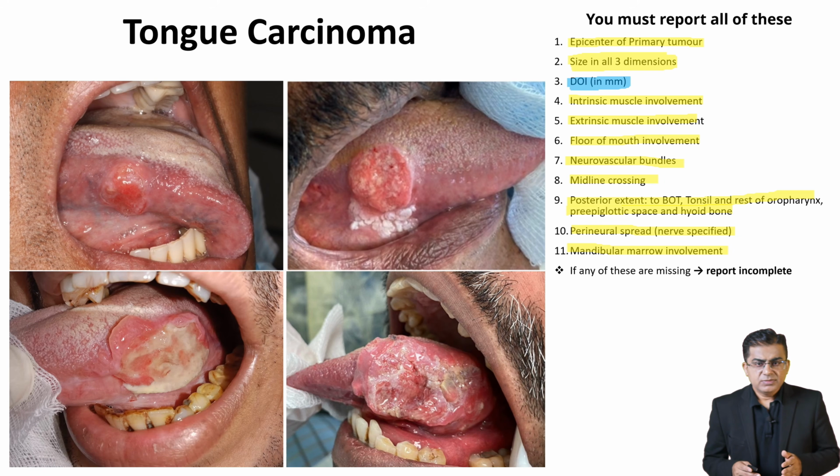Listen carefully. If you miss even one of these parameters, your radiological interpretation is completely inadequate for surgical planning. So ask yourself a very practical question. Which imaging modality shows the superior soft tissue contrast required to give us all this information in detail? CT or MRI?